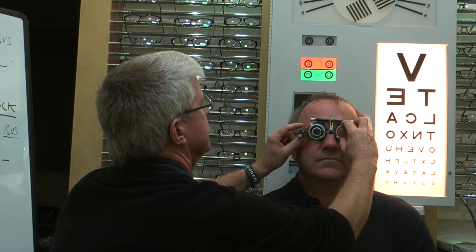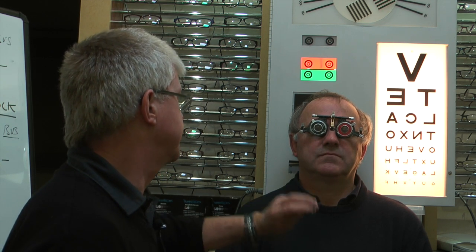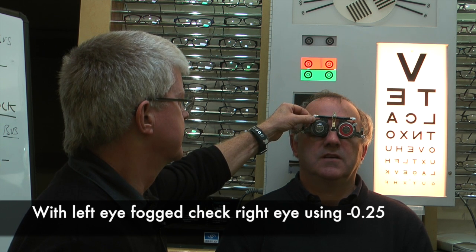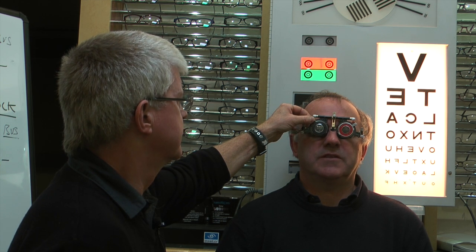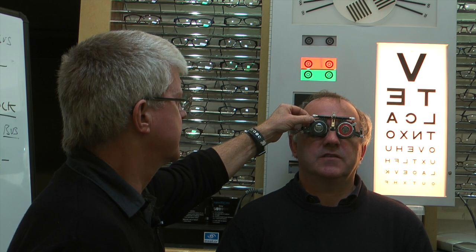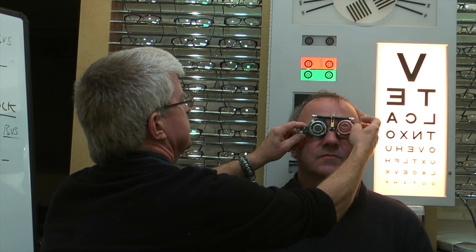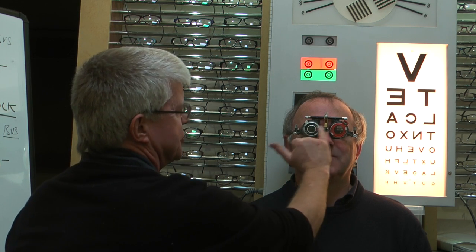We've put a plus 0.75 in the left eye, fogging it out, and we're double-checking the right lens. Looking at the chart — does that make it any clearer? It's very marginal, very slightly better but very hard to say. So we're staying with the minus 3.25 for the right eye. Note: both trial lenses here are minus, just from two different trial sets.